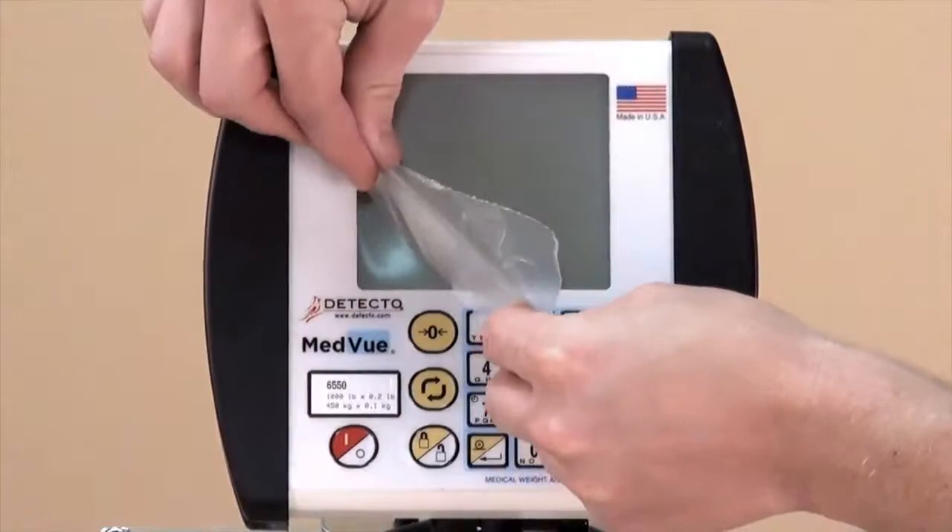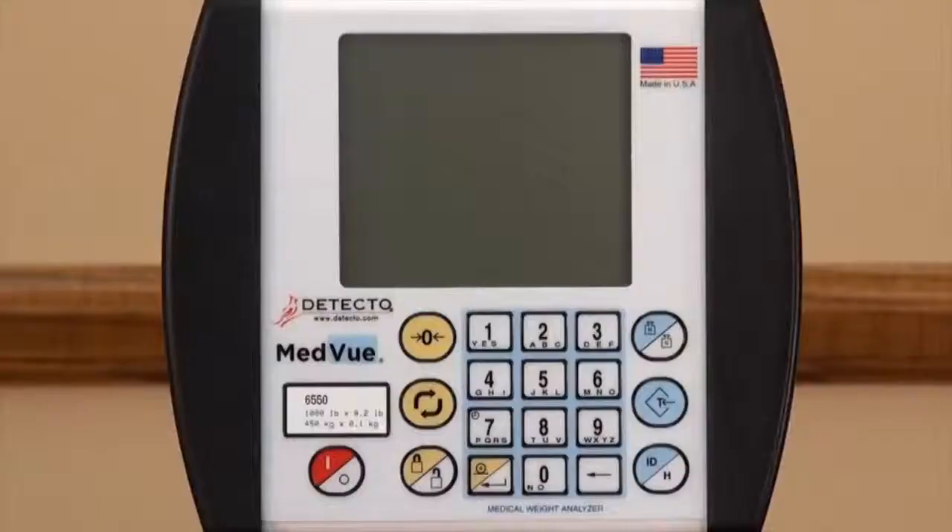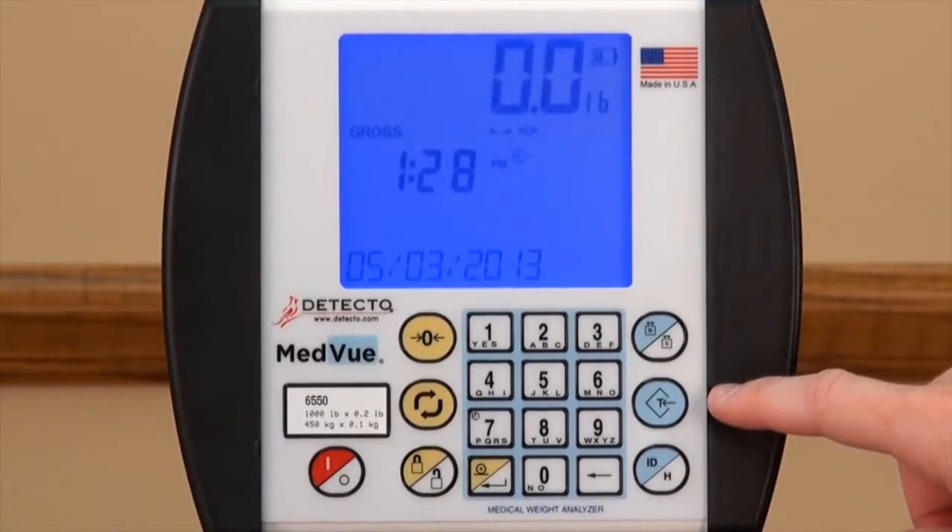Before operating the scale, remove the protective plastic from the indicator's keypad. Turn the scale on by pressing the red and white on-off key. In order to get a patient's weight without the weight of the wheelchair, use the tare function.